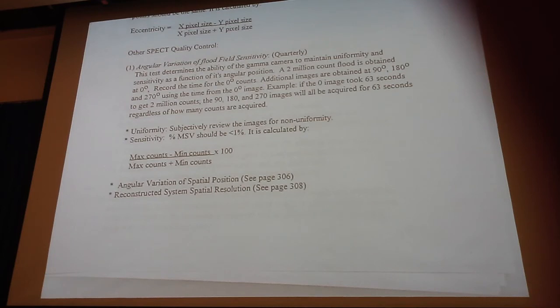Yeah, and normally you can adjust it by raising or lowering the height of your table, making sure that it's right in the center. That's the important thing. If it's not in the center, then you're going to have a problem. You have your grids, and you also have the table height and things like that. Normally it has to be in the center of what we call the field of view. Remember that the field of view is what your detector actually sees when it goes around. For most of our systems, the fields of view are typically about 30 centimeters, and some of them are larger.